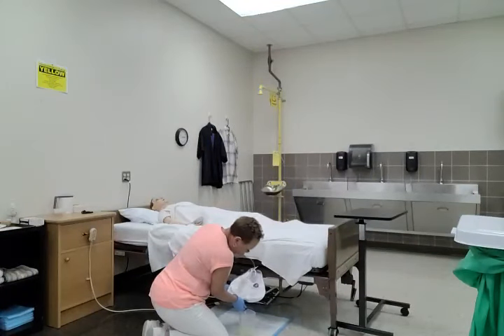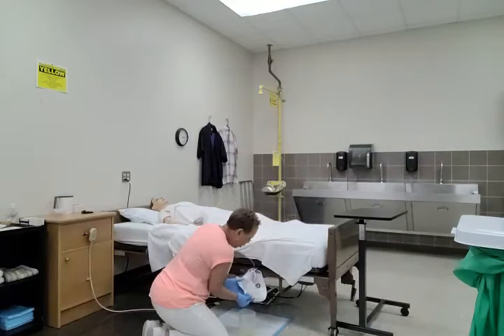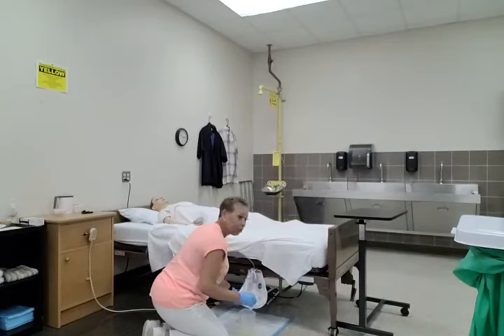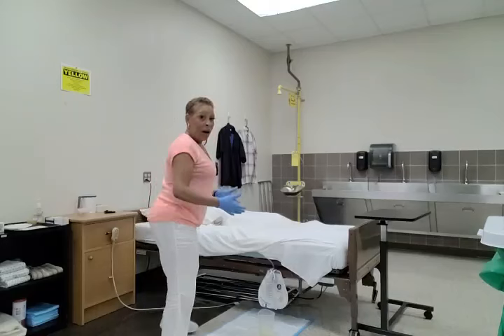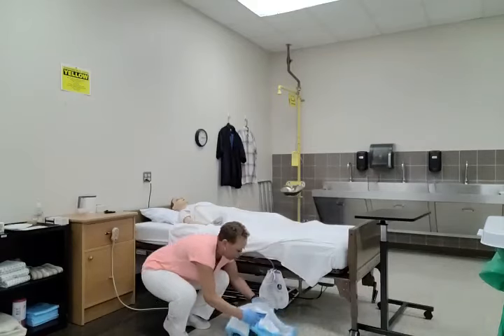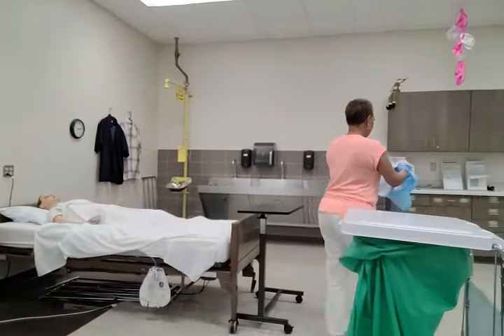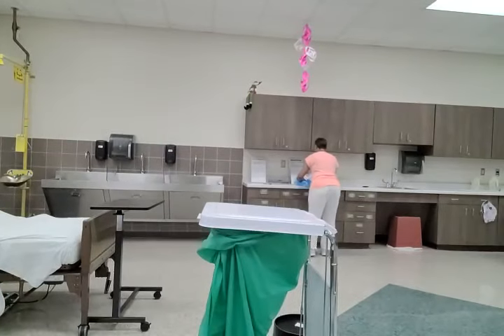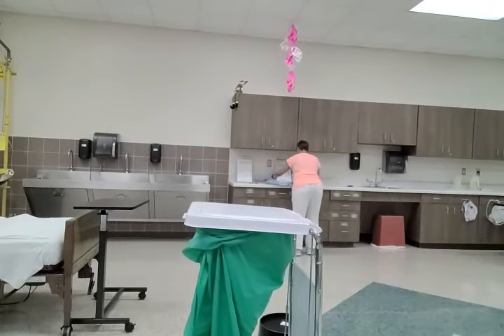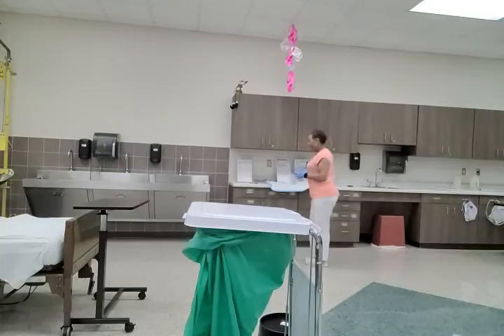Now that I've drained all of the urine from the drainage bag, I'm going to close the valve and then replace the tube in the holster. Along with my clean barrier, I'm going to pick up my measuring container and bring it to a hard level surface. I'm going to wait just a few seconds so the wave-like motion of the urine will stop.